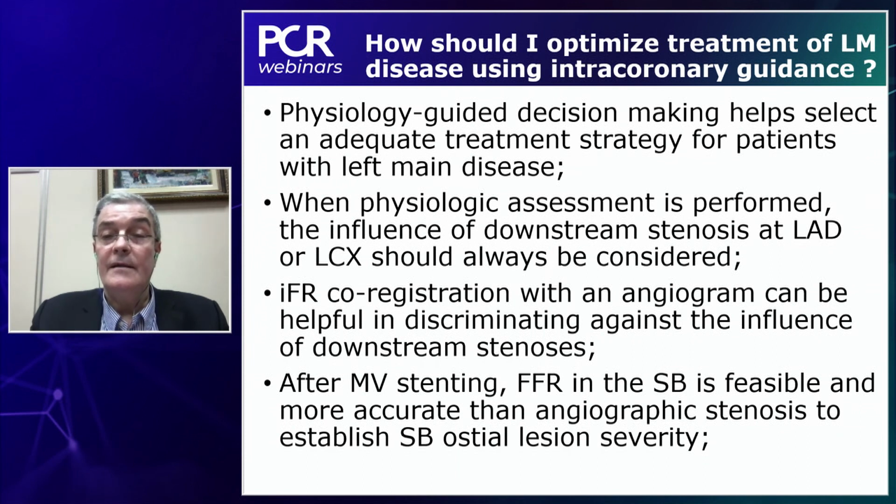So this was a very important webinar because we really discussed in real life using case examples and the best available evidence from the literature how to optimize treatment of left main disease using intracoronary guidance. And we can say that physiology-guided decision-making can help selecting adequate treatment strategy for left main patients.